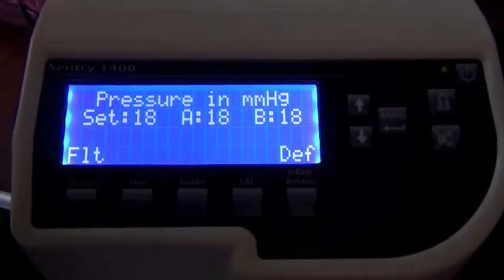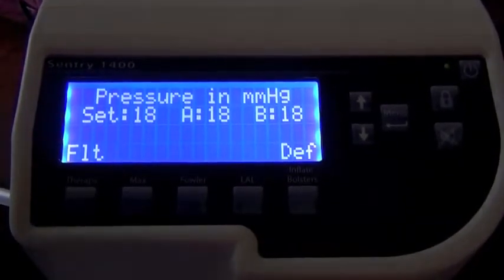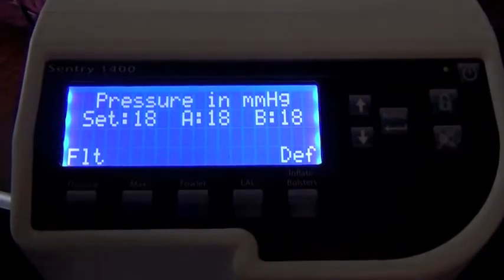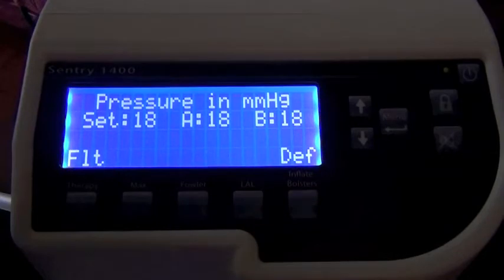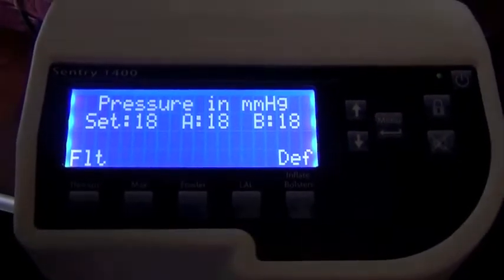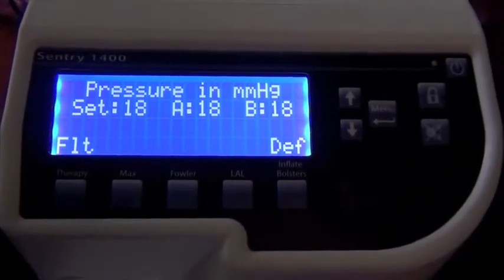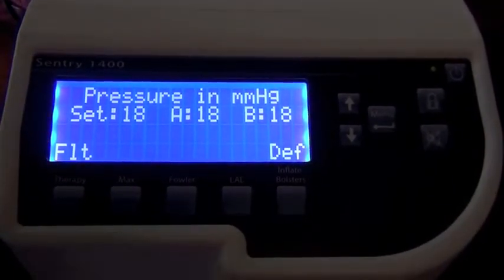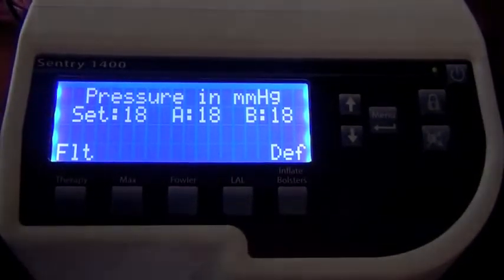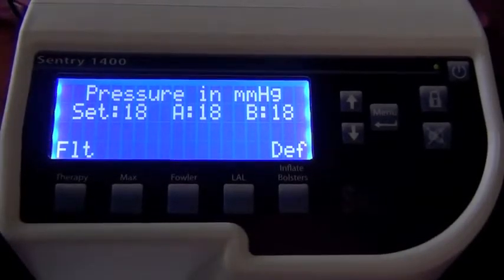And that's important because we want to make sure that we have sufficient amount of air in the mattress to provide support and therapeutic support, but not so much that it creates discomfort. Alternating pressure systems historically have been deemed as uncomfortable, and their popularity for a long time was not advanced because of that negative feature. But with today's technology and the ability to enter the patient's weight, we now only subject the patient to as much pressure in the system that is necessary to provide lift and no more. And so comfort, which at one time was foreign to this product, has now become inherent to the product because of the ability to make that type of an adjustment. So that's what we're doing by entering the patient's weight.